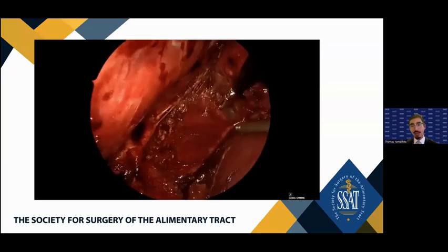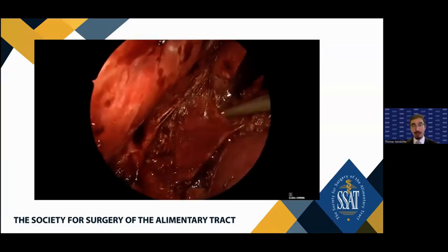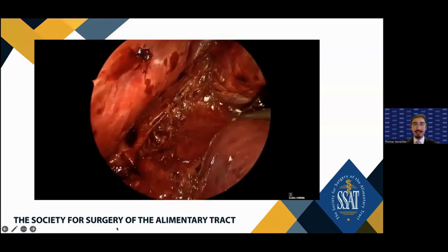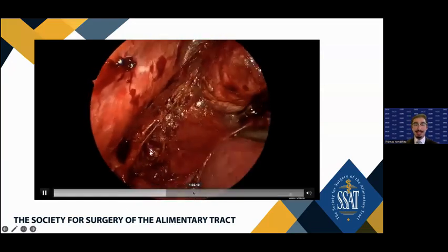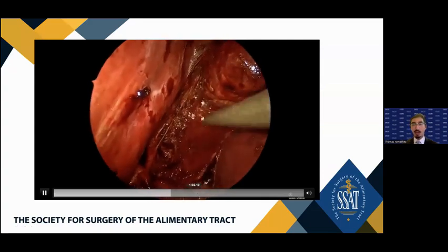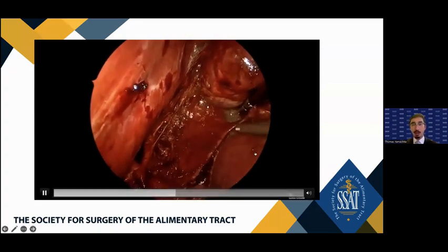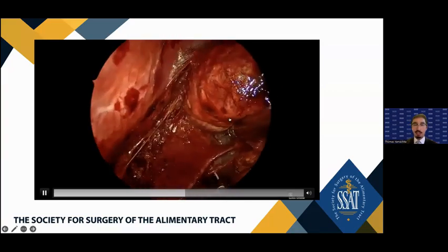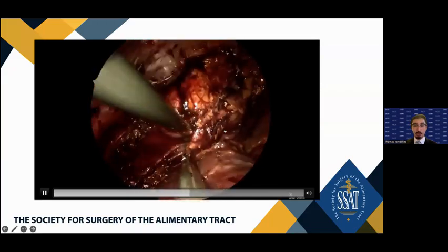The kidney keeps on getting up, so you have to go underneath it and push that down, which is what I was doing there, and just keep getting on the adrenal vein. Similarly, as I mentioned before, the vein can be taken with whichever clips you want. I do 2 clips on the stay side and take it with the harmonic. You can see the tumor right underneath my grasper there, with gentle pushing on it because it is a pheochromocytoma.